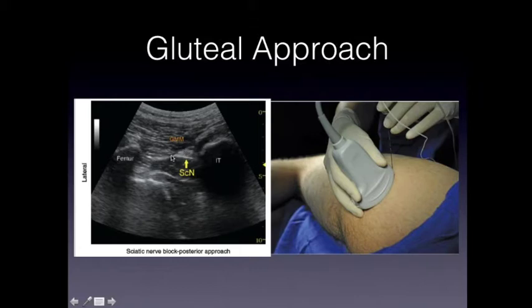It's like a flat or lip-shaped structure. And the muscles, which are hypoechoic. Okay, this is a very superficial image of the sciatic nerve because normally the nerve is deeper. It's like 5 to 6 centimeters. Here is like 3.5 centimeters, which makes it easier for us to depict the nerve. But it's not always like this.